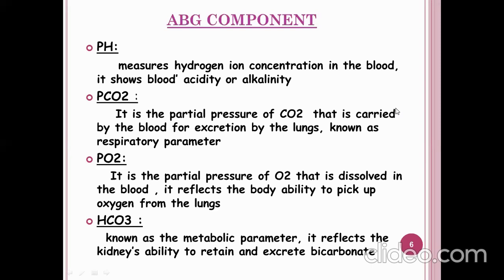That's the metabolic parameter: how much ability the kidney has to retain and excrete bicarbonate. So these four parameters are important components of ABG, arterial blood gas analysis.